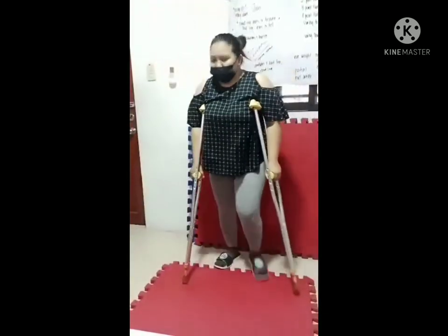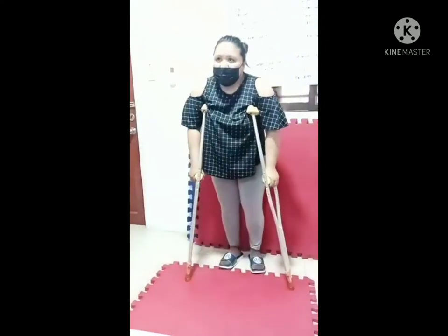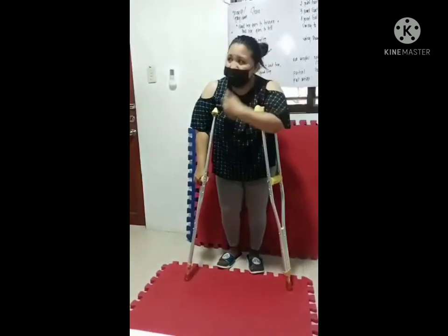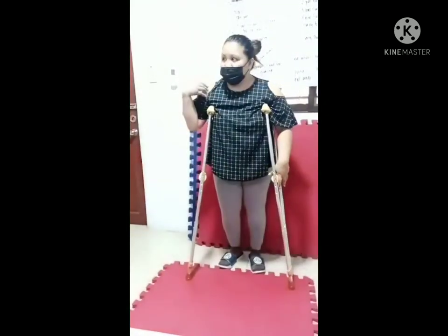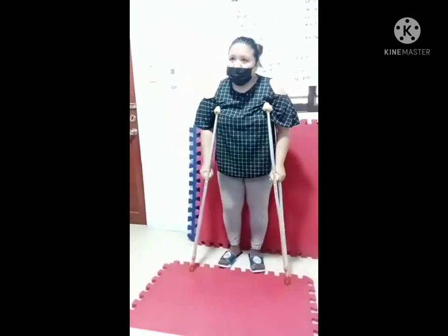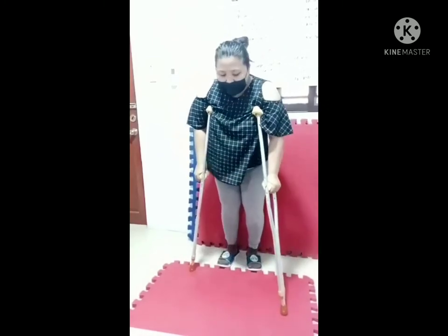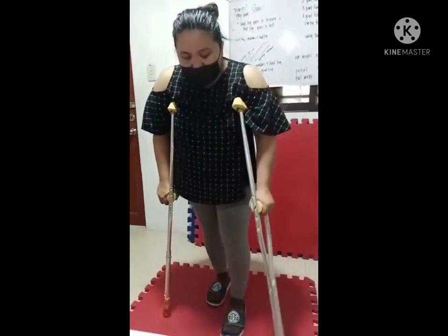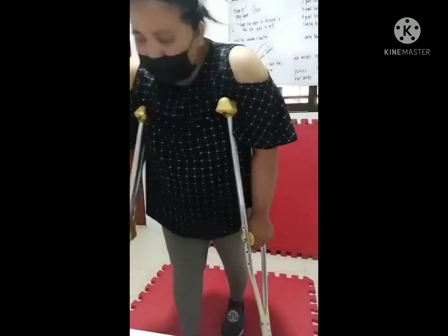Four-point gait. If the patient has right-sided paralysis, the sequence is: good crutch, bad leg, bad crutch, good leg. One, two, three, four.